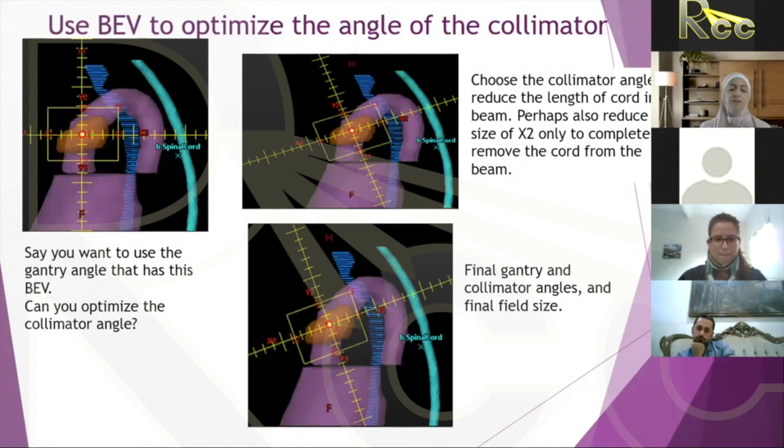If I'm 5 millimeters away from the PTV, your machine better satisfy, it must satisfy the tolerance limit, right? That's the first thing. Now let's say your machine is really good. You can verify the mechanical tolerance of your gantry, and so on. What about organ motion? You don't want to be very close to the PTV if you cannot guarantee some type of motion management. So when I chose lung, because lung is really the hardest to plan because so many things go on in the lung. I could have chosen something simple in the pelvis or the brain.